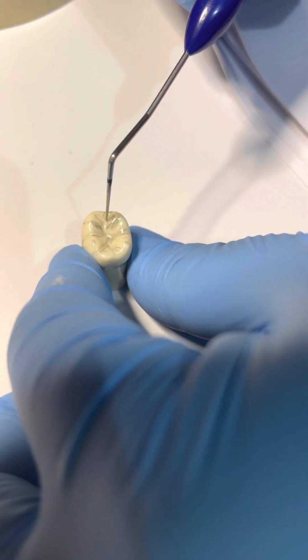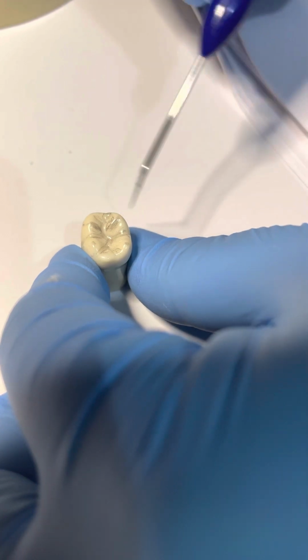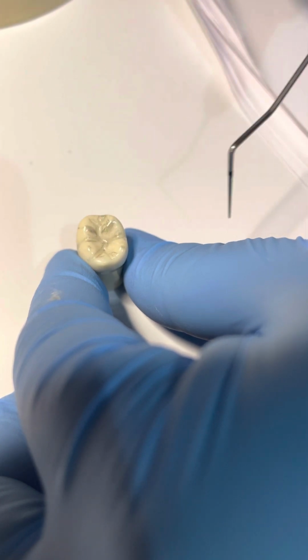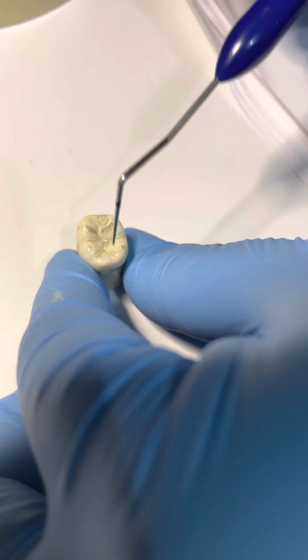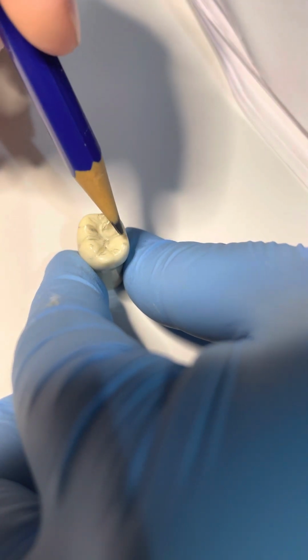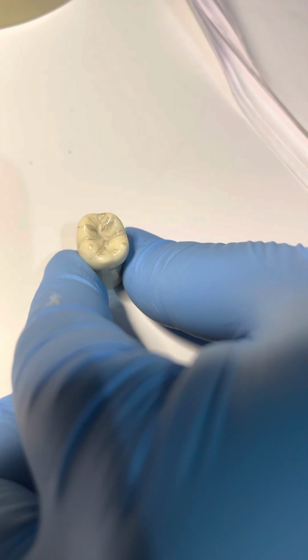So you finish with the mesial fossa here, right? And then your marginal ridge will be built up automatically. First you do your M and then do your Y. So this is your Y. This is your distobuccal, and you'll see the distobuccal tip is on the top of everything, right? This is the M. And this is Y.